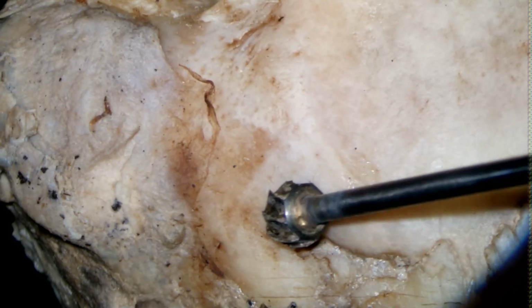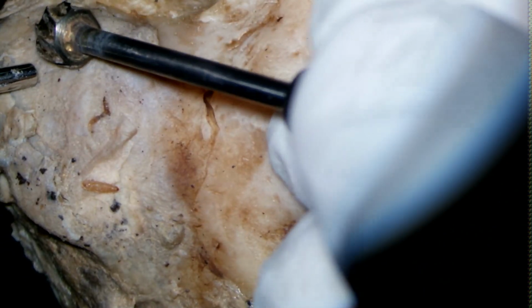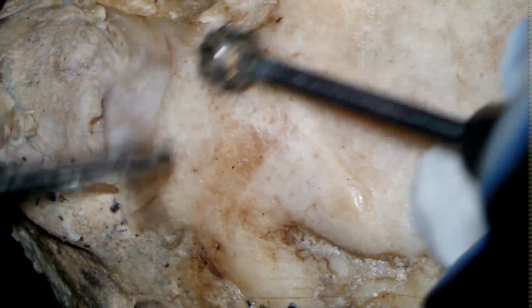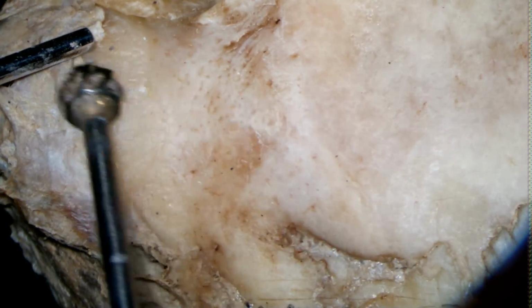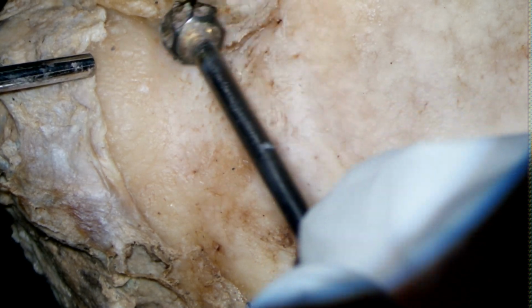Okay, right. So this is the temporal line, right? So the inferior temporal line, the posterior canal wall, and a line joining these two lines, right? So this is basically the triangle of attack, right? And in between this triangle, you have to drill. The depth of the mastoid antrum is around 1.5 centimeter, and you have to be careful that you do not delineate the dural plate here superiorly, and delineate the sinus plate here posteriorly, and preserve the posterior canal wall. So that is also important, because we are doing cortical mastoidectomy. It is a canal wall up procedure, and we have to preserve the posterior canal wall, right?